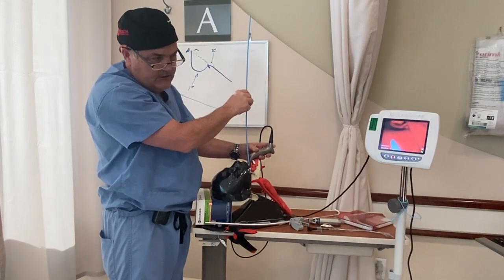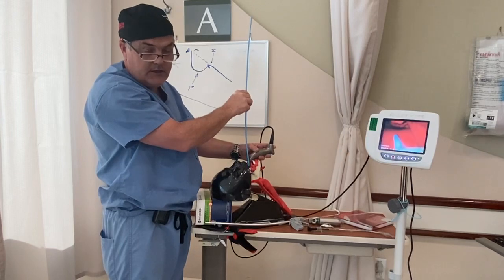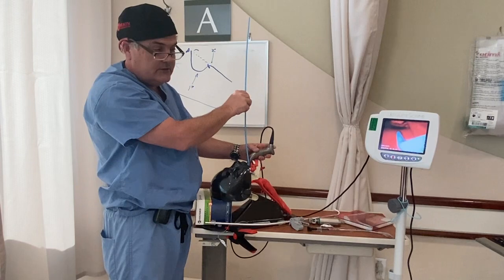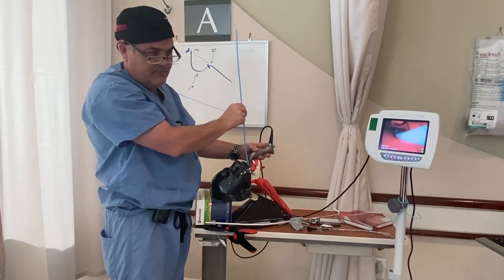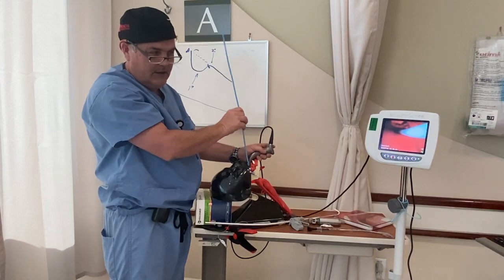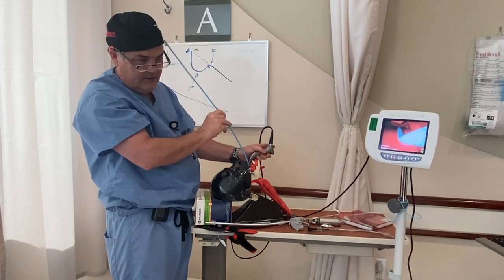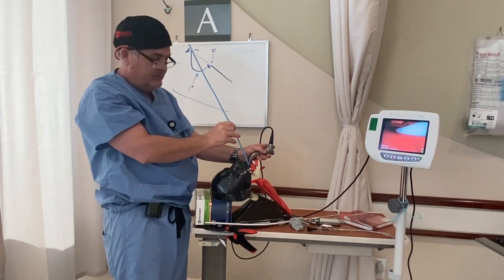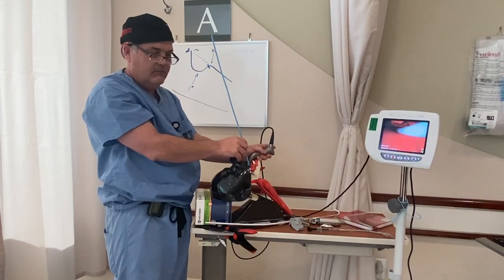When residents can see the vocal cords, I stop them there and bet them dinner they can't get the bougie tip into the trachea. Everybody takes me up on it and I win a lot of dinners. You'll see the tip goes right down the esophagus — because the bougie is linear and we're working around a curve. No matter how much adjustment is made, the primary curve restricts the ability to move that tip around.